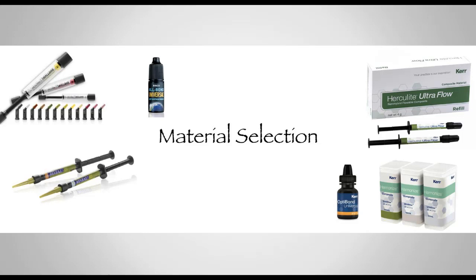For the cases that I want to restore temporarily, that I want to use as a prototype only, just for a couple of weeks, I prefer to use flowable composite, because it's a lot easier to apply. It's quicker, you can do multiple teeth at the same time, and it's predictable. I use this technique as well when I want to restore mandibular incisors for patients where I need to alter the occlusal plane, or patients who are going to end up using some type of removable prosthesis in the contralateral arch.